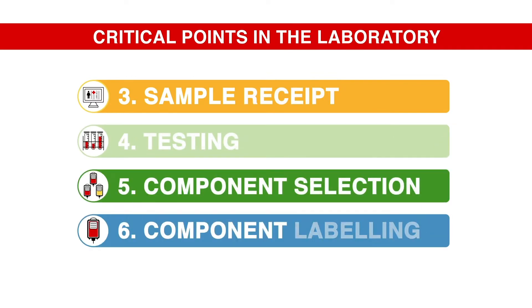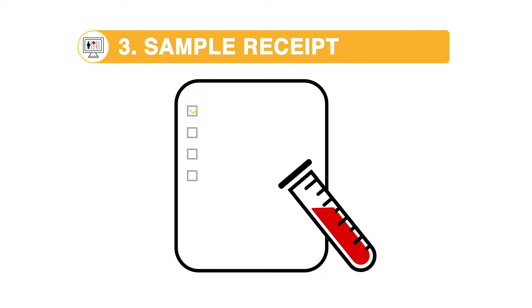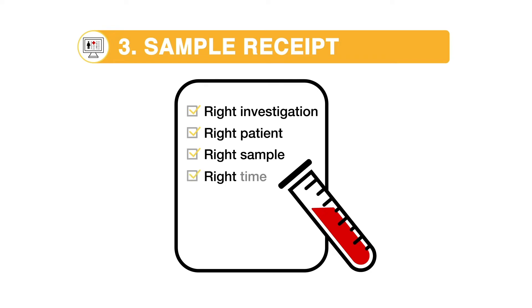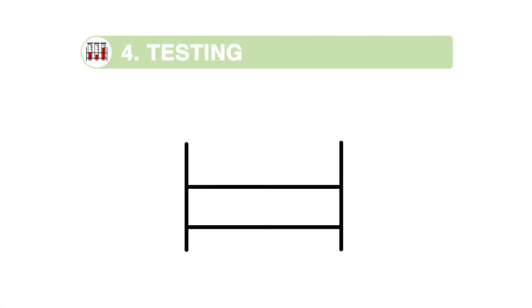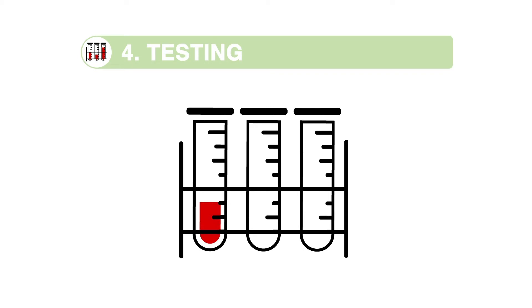These four stages are critical points in the laboratory. Sample receipt and registration: the right investigation is performed for the right patient on the right sample at the right time. Testing: the correct and accurate analysis of samples is required to ensure the safe provision of blood components for transfusion, undertaken with full compliance of local and national guidelines for pre-transfusion testing.